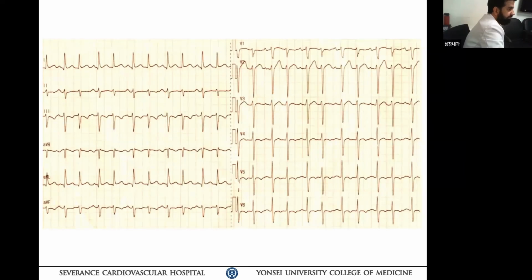Yeah, 560. So, because of my humble and limited experience, I want to ask Dr. Park: have you ever seen the AH interval measuring like 500 or 600 milliseconds? Really? Yeah, I saw. I have not. So my answer is simple. I saw. But I haven't seen yet.